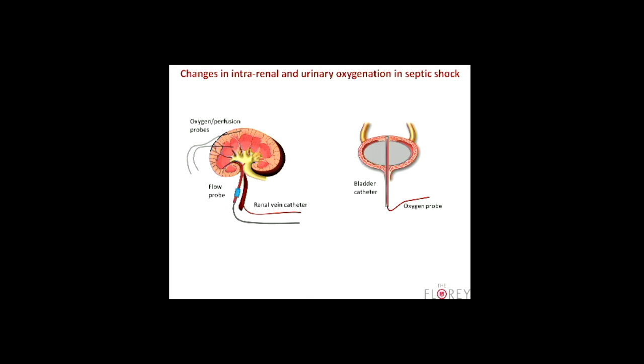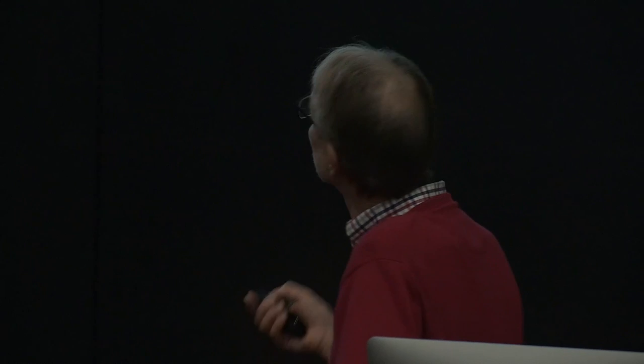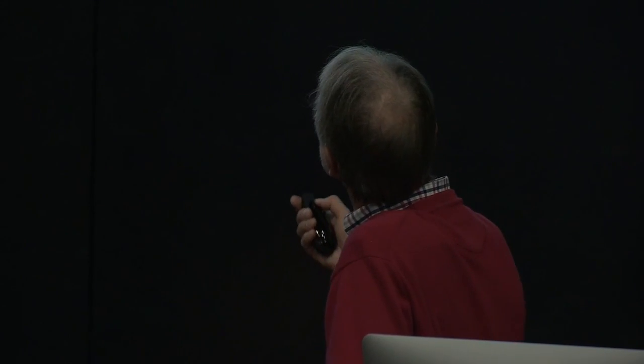And as well as that, we also have been putting an oxygen probe into a bladder catheter. So here in grey shows you the bladder catheter with a balloon, which they have inside the bladder. And we put this oxygen probe up to the tip of the bladder catheter. And here you can see the ureters, which are the two tubes that come down from the kidneys. The urine comes down into the bladder. And all patients in intensive care units have a bladder catheter. So it's relatively non-invasive just to put this probe up into the bladder catheter. And we're actually having discussions with a couple of companies at the moment who are interested in developing a bladder catheter that has this probe embedded in it. And I'll explain to you why we're interested in measuring the oxygen levels in the urine.